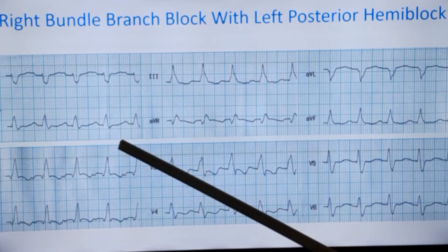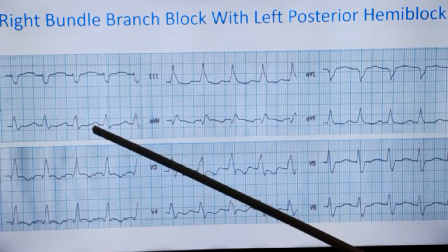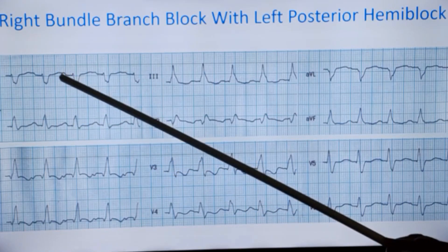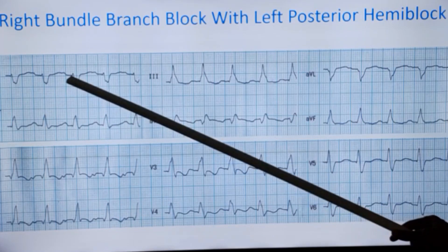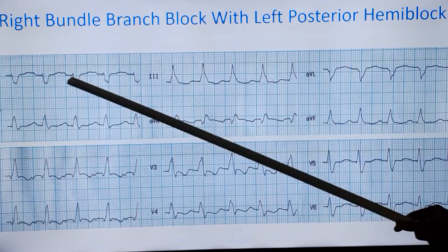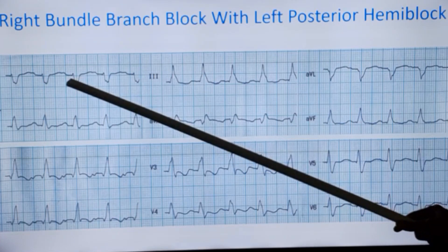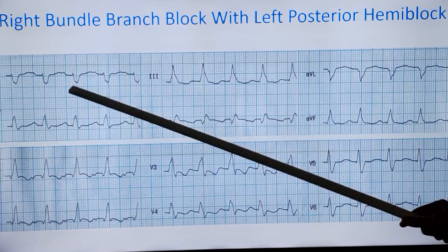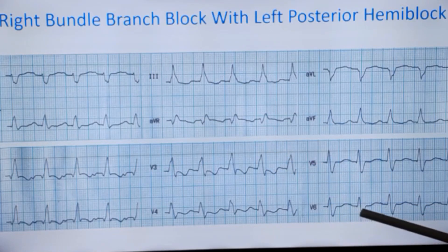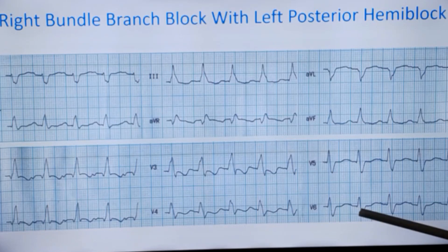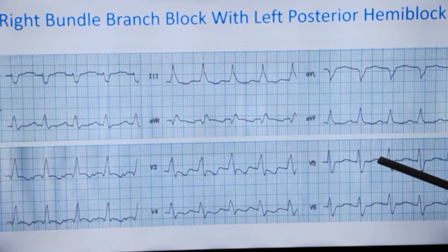This ECG is showing sinus rhythm. You can see P waves — the T and P are almost merging together, but you can see the P wave here. This is the P wave and the PR interval is on the upper limit, almost 200 ms. At one look you can see that the QRS is wide, so there is a conduction disturbance. The QRS is almost 160 ms — four divisions. So it is a wide QRS with the upper limit of normal PR interval, fully in sinus rhythm.